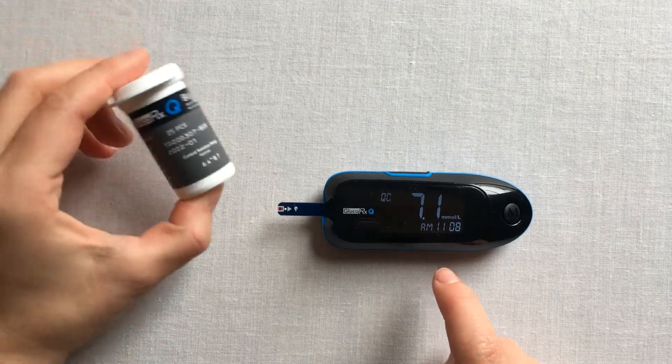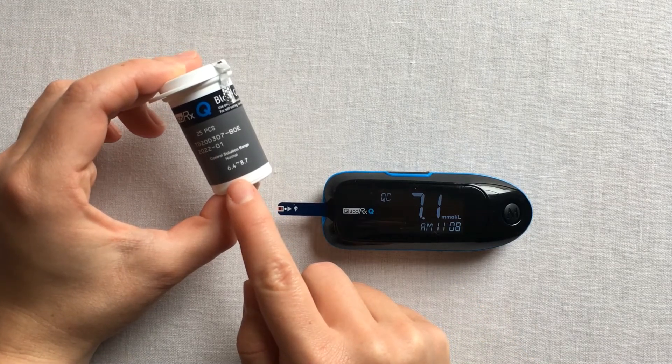Compare your result with the range printed on your test strip vial. Your results should fall within this range.